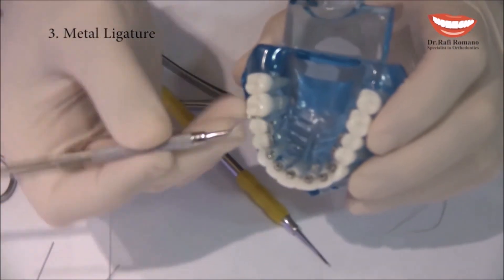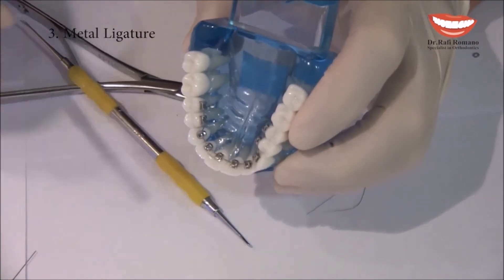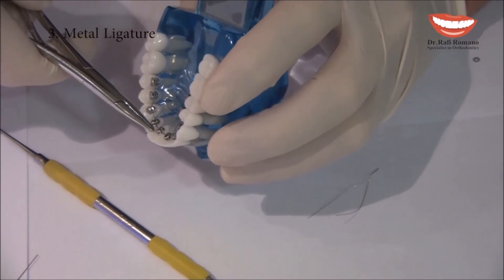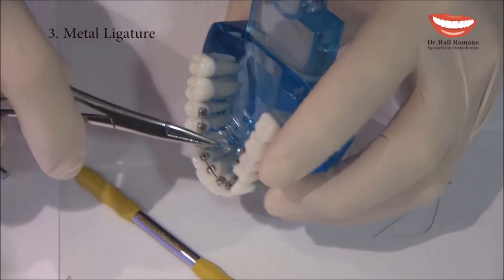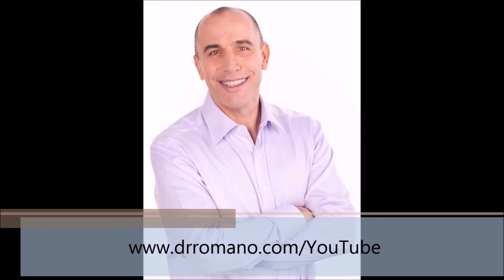When you want to reopen it, I take the explorer, I take this extra wire that I left and pull it out. Then I take the mosquito, change the angle, and take it out.